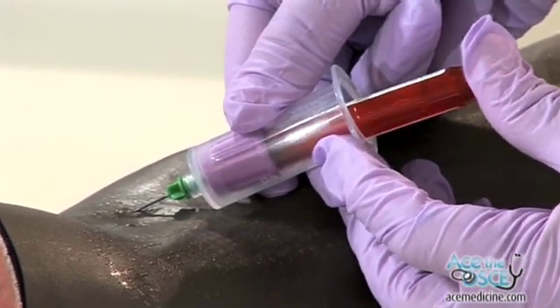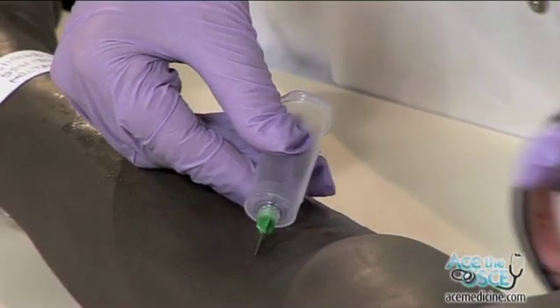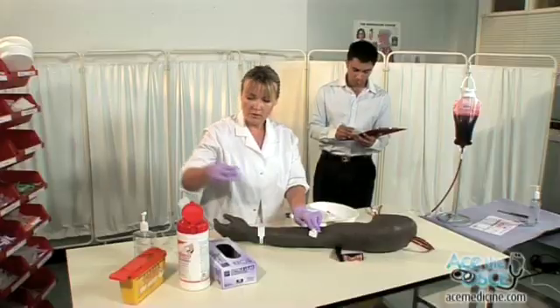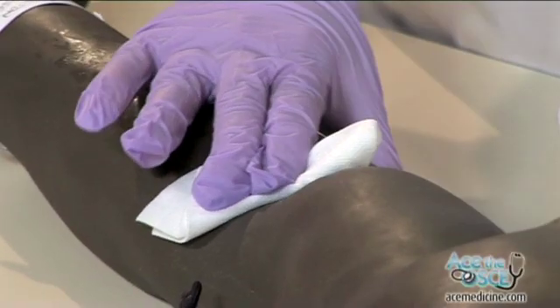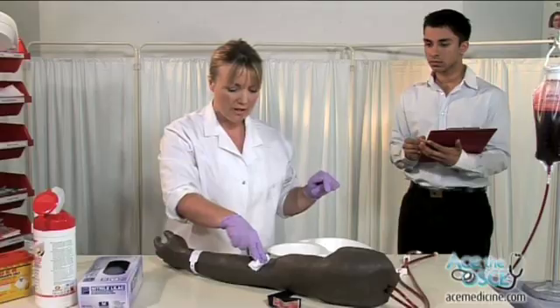Hold the skin taut and insert the needle at 45 degrees into the vein and introduce the Vacutainer bottle. Allow the blood to collect. Remove the blood bottle. Remove tourniquet. Remove the needle from the arm and safely dispose of the needle into the sharps bin.